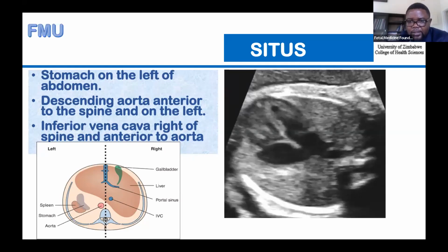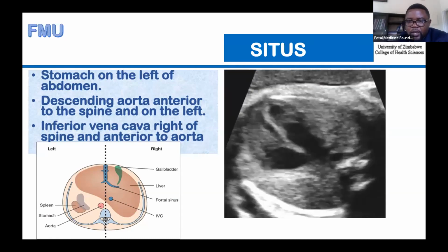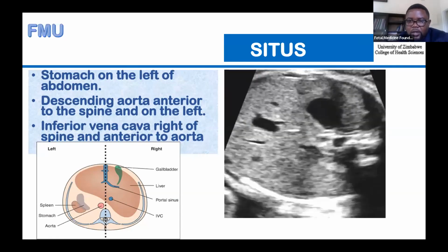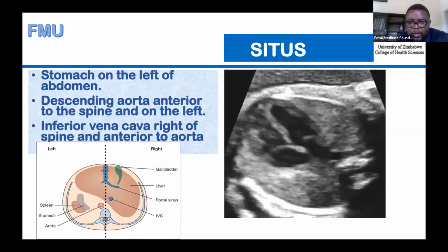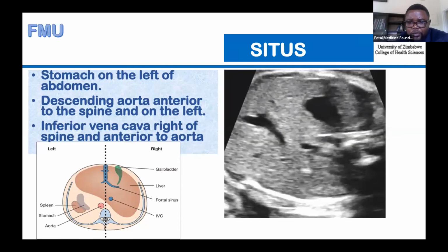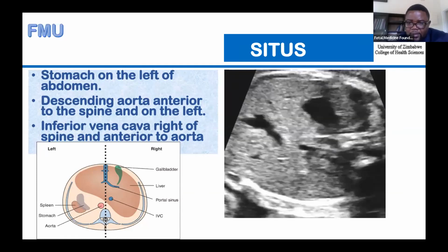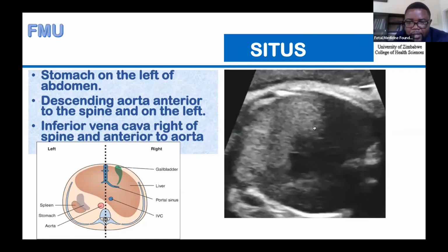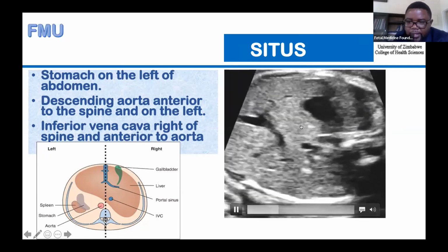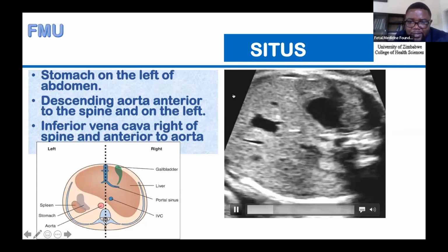So very easy signs, but in most cases, the patients we have diagnosed with either dextrocardia or those with left isomerism, with heterotaxy, most of those cases were missed. They are actually reported as normal because this simple maneuver is not being done the way it should be done. So if we do it properly, it is very easy to see that, look, the heart and the stomach are not pointing in the same direction.